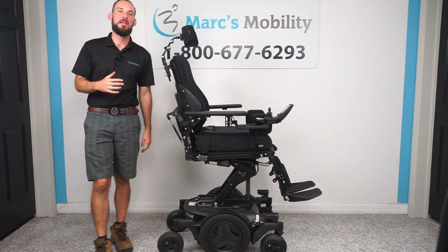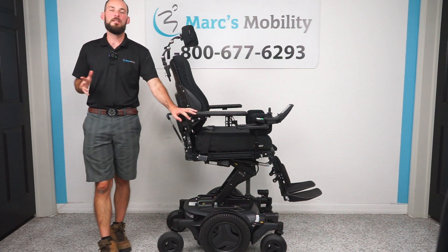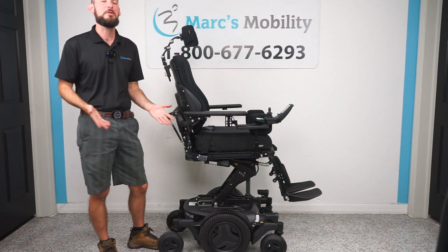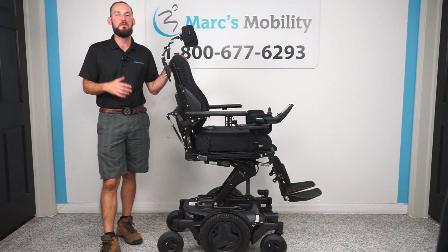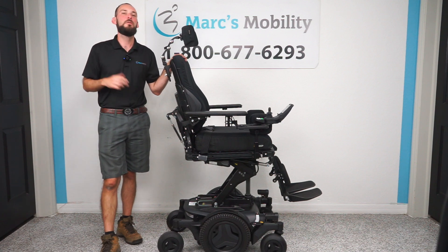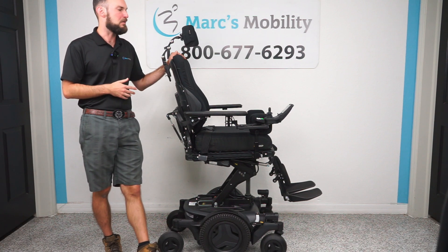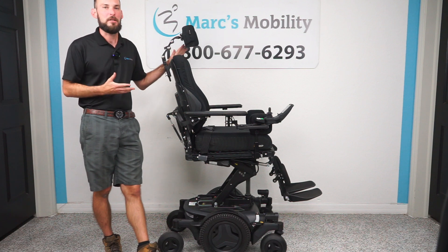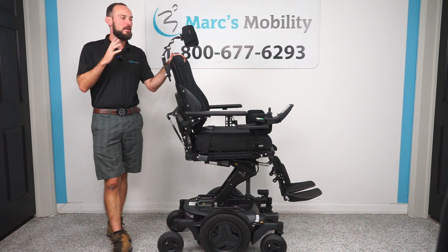There's actually an app this time instead of a programming dongle that you would have used on the older version, so I'll show you how to connect to that. This is primarily going to be a dealer video, not necessarily something that customers can use, because you're going to need dealer login info. Unless you have an account with Permobil, you will most likely not be able to access this — same as with the older version where you need a programmer. They just don't want customers constantly changing memories and causing issues. So this is primarily for anyone who's a dealer or works on Permobil and has access to an account with the app.